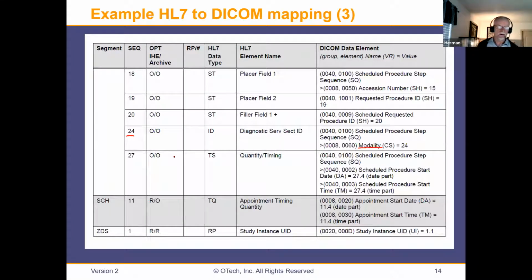I was looking at a message yesterday with one of the PACS administrators. Actually, they put it in OBR-21. So you see, every hospital is a little bit different. This PACS put it in OBR-24. That one was expected in OBR-21, and it was not filled in. They had to fill it in there. Right? And very important, the study instance UID. Study instance UID.